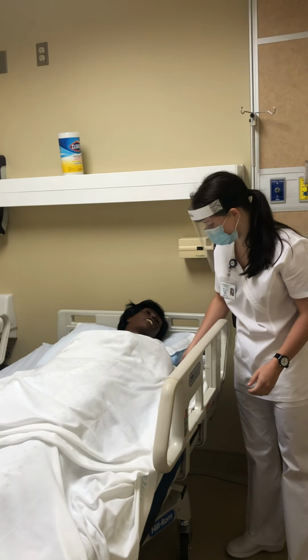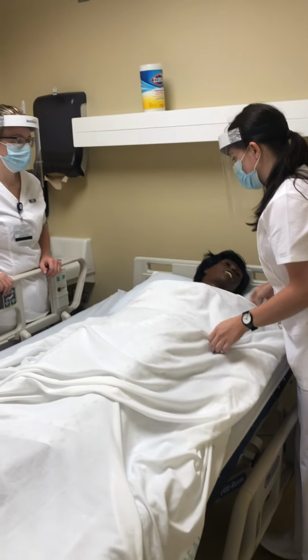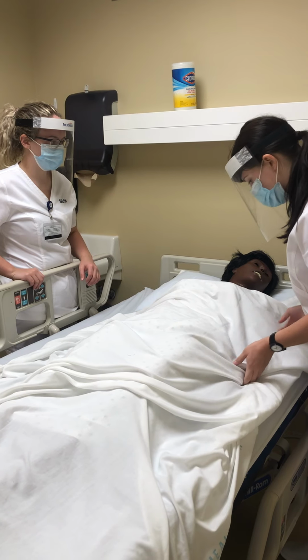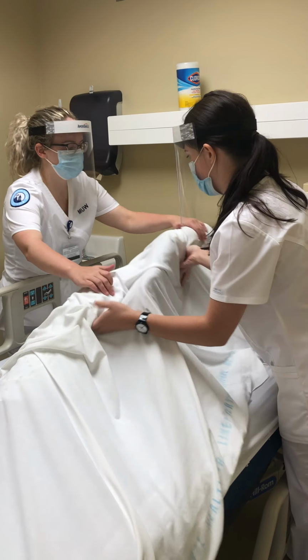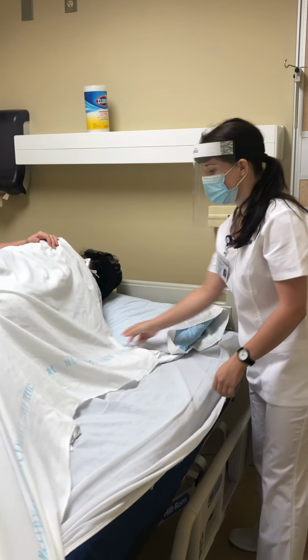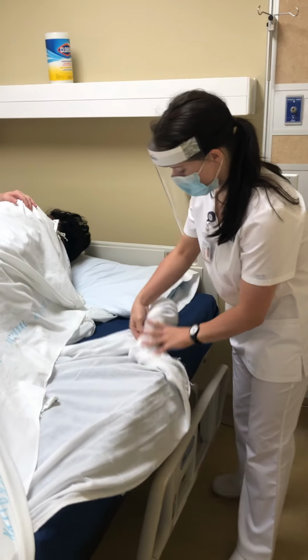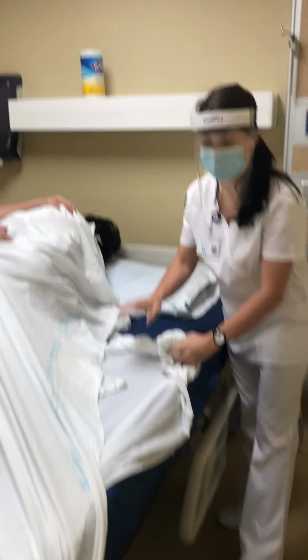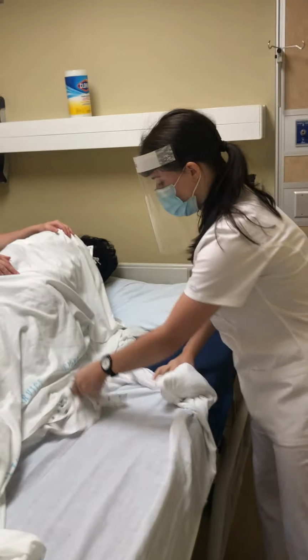I'm going to do the same thing on this side. I'm going to lower the bed railing, and I'm going to turn her over. Again, Morgan will be assisting me, but I would normally ask the patient to hold the guardrail. Keeping the patient covered, we're going to remove this side and start rolling, keeping the contaminated part of the bed linen contained.